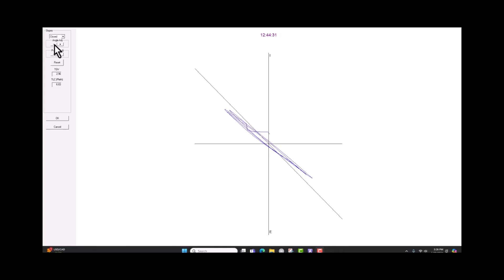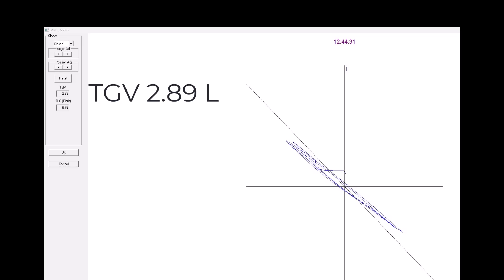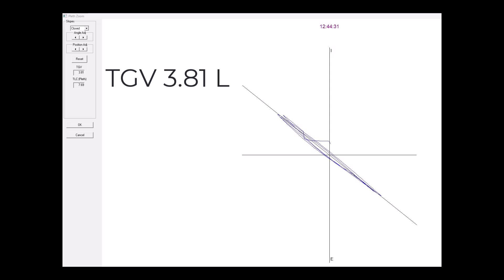As you adjust the line of best fit, the TGV value automatically changes. Note that you should not adjust the line of best fit to get a value — adjust the line to the same angle as the tracing. The more up and down the line, the smaller the value. The more horizontal the line, the larger the value. Once any adjustment has been made, click the OK button to save your changes.